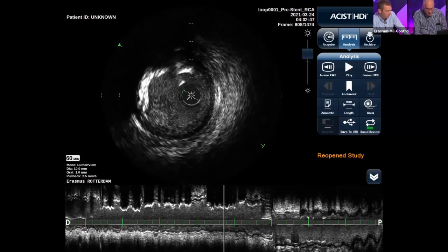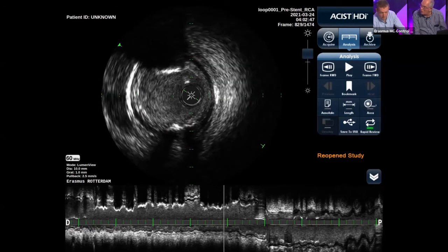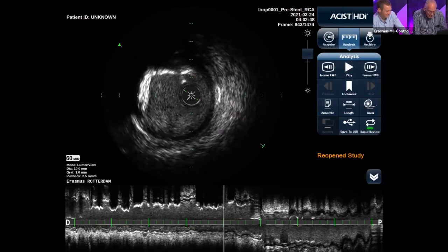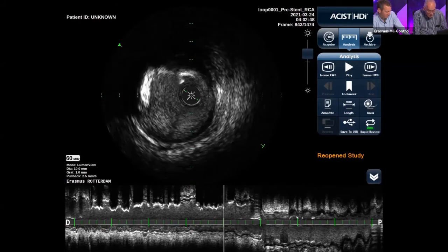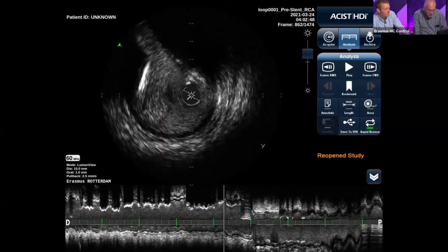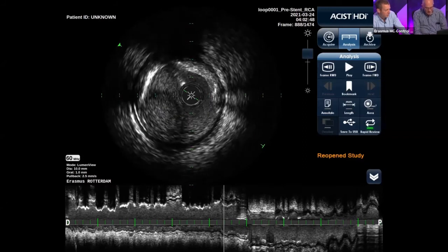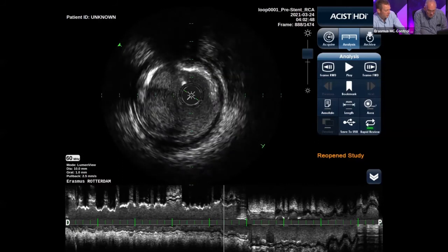Yes. So I don't see any questions yet. So I think everyone gets it. I think Jurgen, you are very clear. Yeah, but I think that everyone will be the expert on thrombus after this. Hmm.